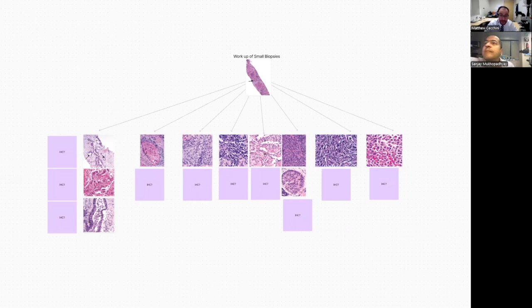We're going to talk about today some small biopsies and approach to small lung core biopsies and immunohistochemistry for them. So maybe before we get into it, Sanjay, do you want to tell people why it's important to think before you just order a bunch of stains on a small biopsy when you're working it up for lung cancer?